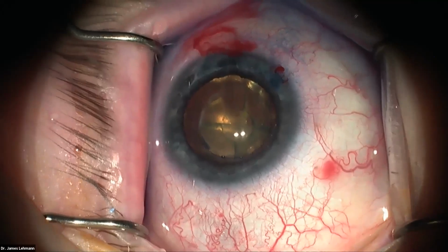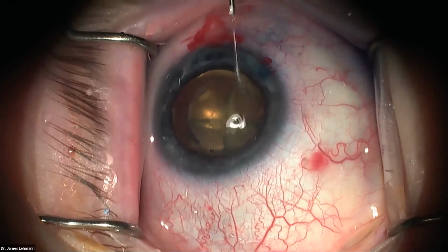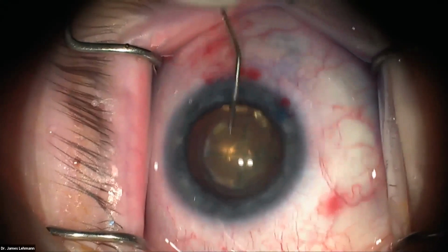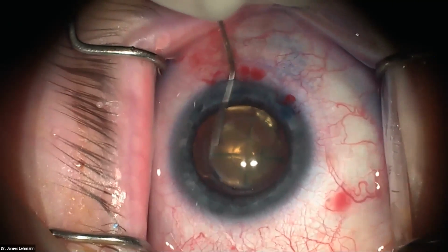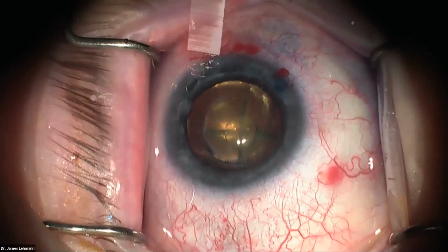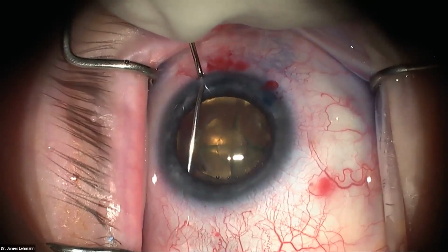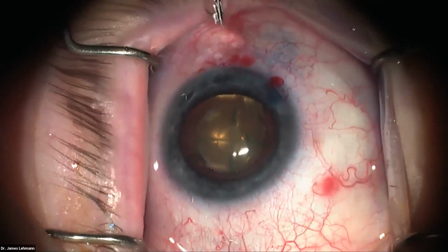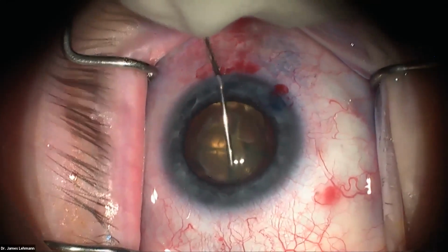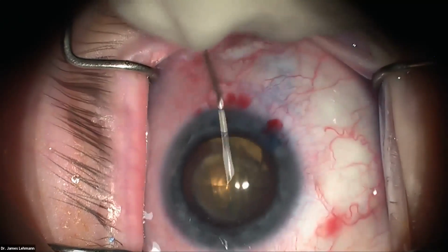So now, one good thing about Femto-phaco is that the hydrodissection part's actually easier. That big distortion you see in the back there, that's an air bubble. And so you've already done a lot of pneumodissection, and now we're just going to do a little bit of hydrodissection right under the anterior capsule there. And you can see the lens come forward and some burping of viscoelastic, and then we're just going to blot down or tap down to try to release some of that excess fluid.